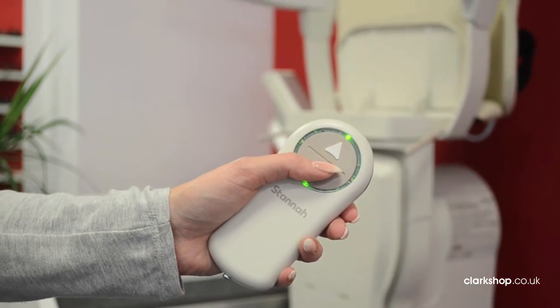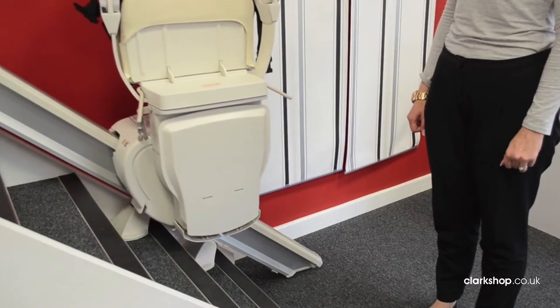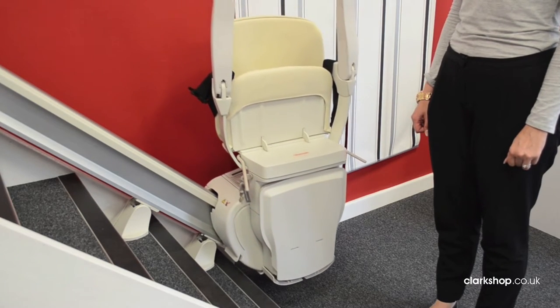The remote has two buttons, one to take the stairlift up the stairs and one to bring it back down again. To bring the stairlift to the bottom of the stairs, simply keep your finger pressed on the downwards button.